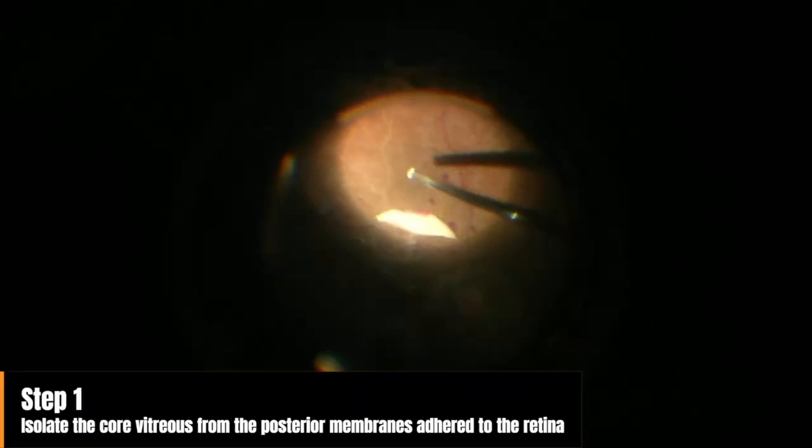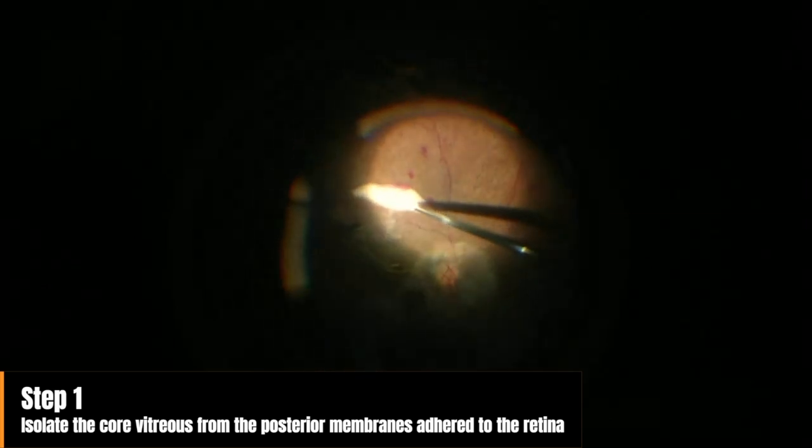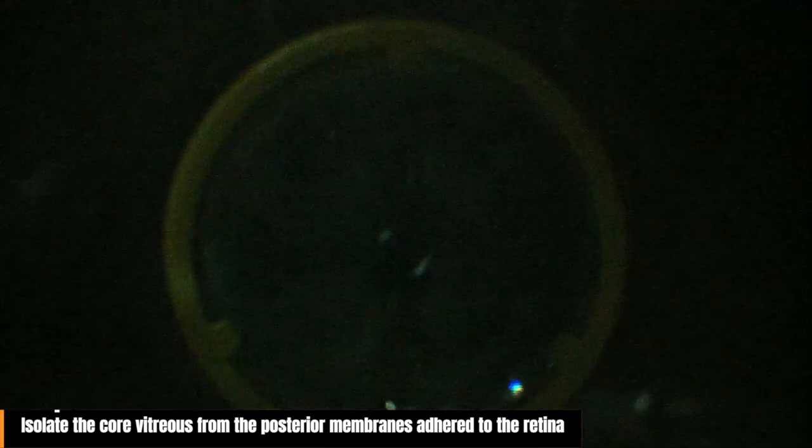So remember that a membrane forms attached to the hyaloid at the posterior pole, while the rest remains slightly free, like a small basket. The first step to consider is to cut or isolate this vitreous from the membranes at the posterior pole. This is to ensure that when manipulating the membranes, you don't inadvertently pull on the peripheral retina and cause a tear.